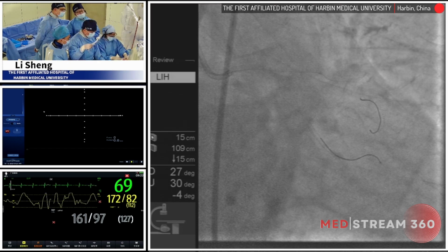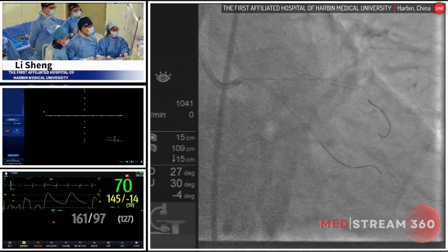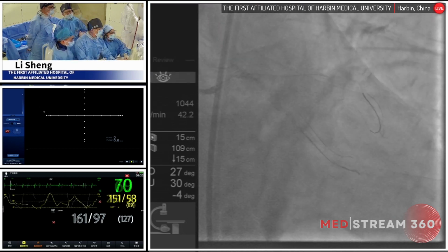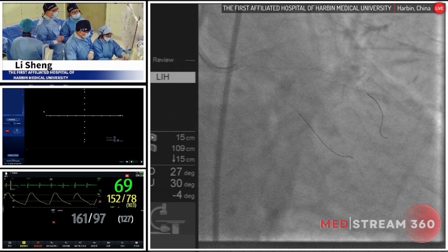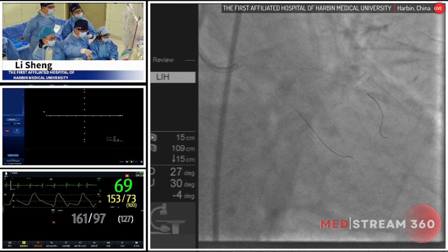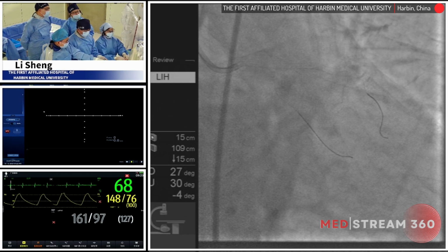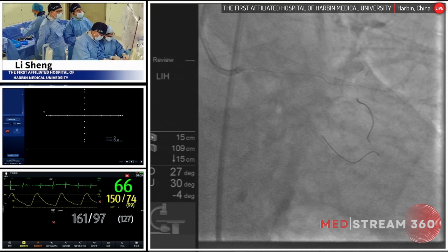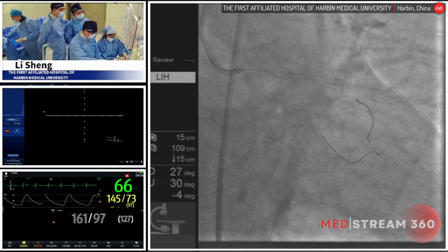Dr. Wang, I think you have been doing the interventional procedure for so many years. Based on your own personal experience, what's the difference between scoring balloon and cutting balloon? The cutting balloon, we all know there are 3 knives on the balloon. It can predilate the lesion more effectively. In my mind, actually, we always have some difficulty to deliver the balloon to the lesion. Your personal choice is you always try the cutting balloon first. If it doesn't work, the scoring balloon with the smaller profile.